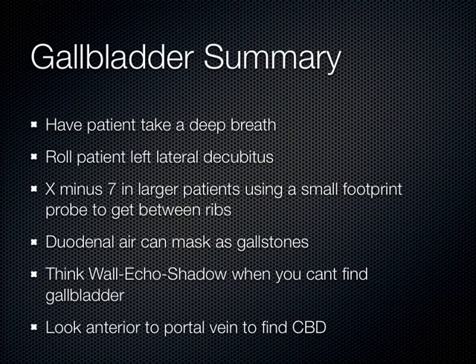So in summary, I think the best way to think about the gallbladder is have the patient take a deep breath. First thing I do, take a deep breath and hold it. Respire profundo. And that's the other thing. You're going to learn a lot of medical Spanish from me as we go through this ultrasound stuff. I'm not just about ultrasound, I'm also about medical Spanish and the way not to pronounce it.